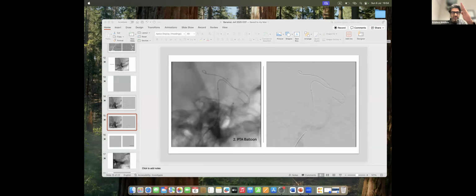Coming from an antegrade approach at this point, correct? Exactly. I think I went higher than I should have. I could have been a bit more proximal and not gone distal to the stent. The balloon went higher in this curve in the carotid artery and pushed everything down. Then I needed to try to push it back. I was lucky, to be honest, to push the things back again. It's not the way it always happens.